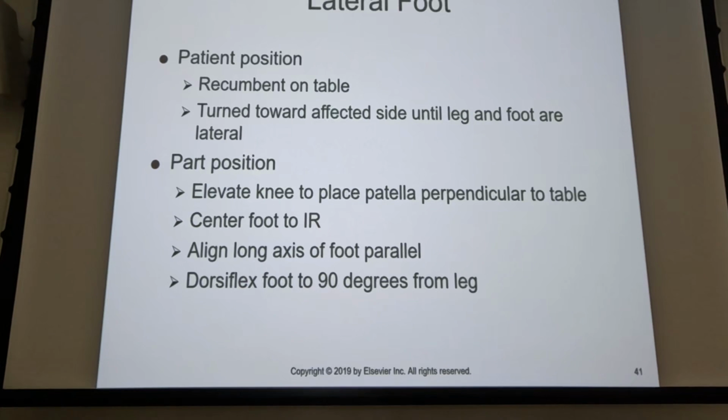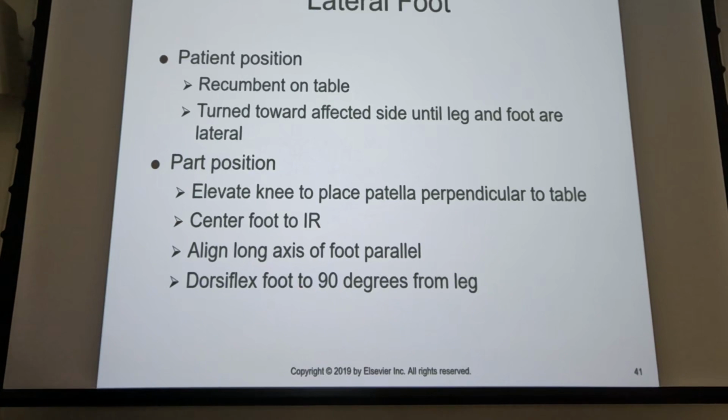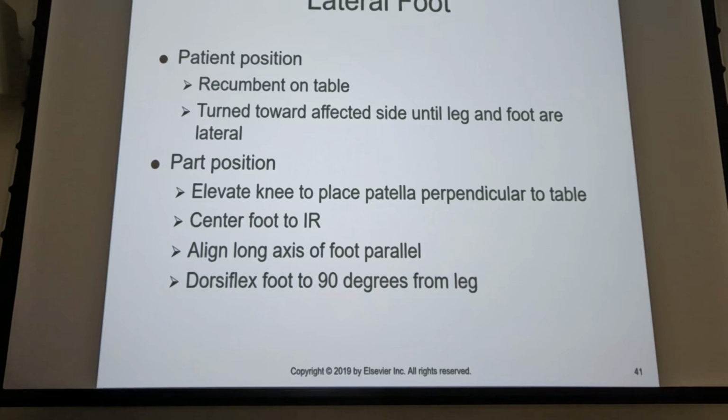The lateral, okay, bears some explanation. So you've got a couple of things on lateral. One is you can shoot the lateral medial lateral or lateral medial. Either way, it doesn't really matter. I do want to bring your attention to something though. This will be our critical thinking question of the day on lateral foot. They took this out of the text, but I'm not sure that you're not going to see this on the registry, so it's worth bringing up.